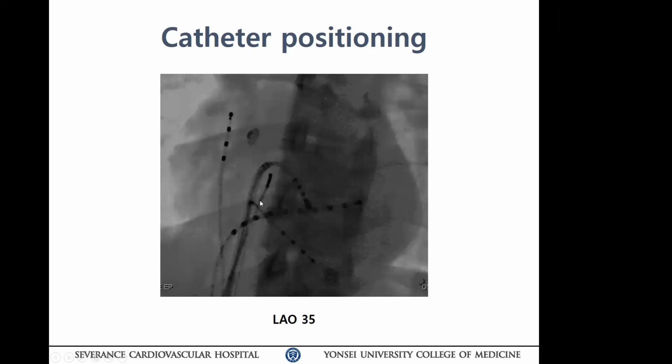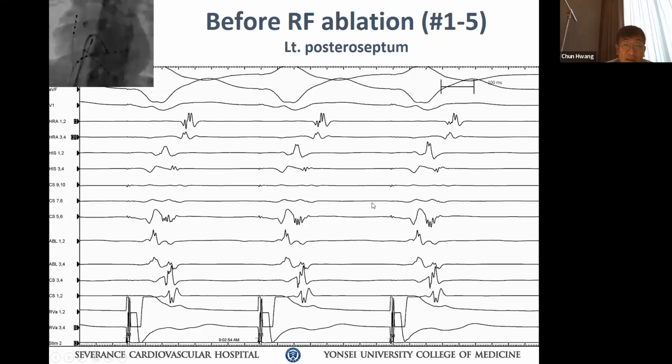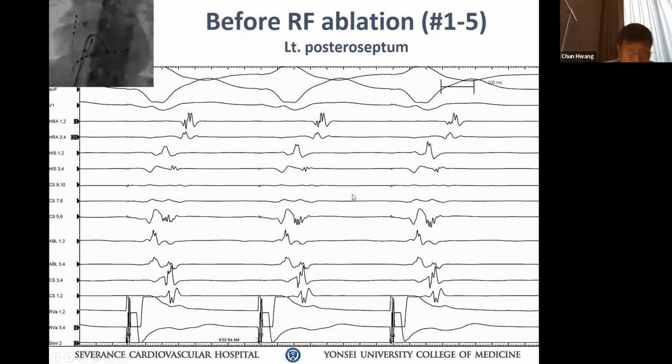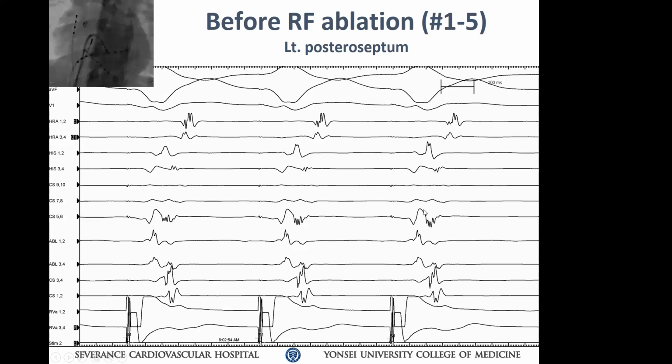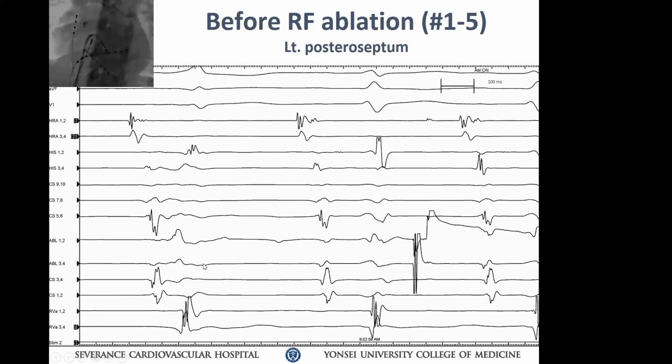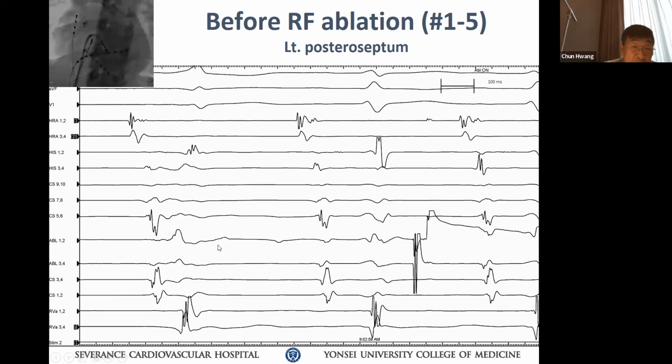어블레이션에서 카테터 포지션은 트랜스셉탈 어프로치. Right. That's septum. Your catheter pointing to where? 4, electrode 4. 1, 2, 3, 4. Okay. Between 3, 4 and 5, 6. Okay. 리페이싱 중에 얼리스트 A를 매핑을 하려고 했었고 Ablation signal. Okay.